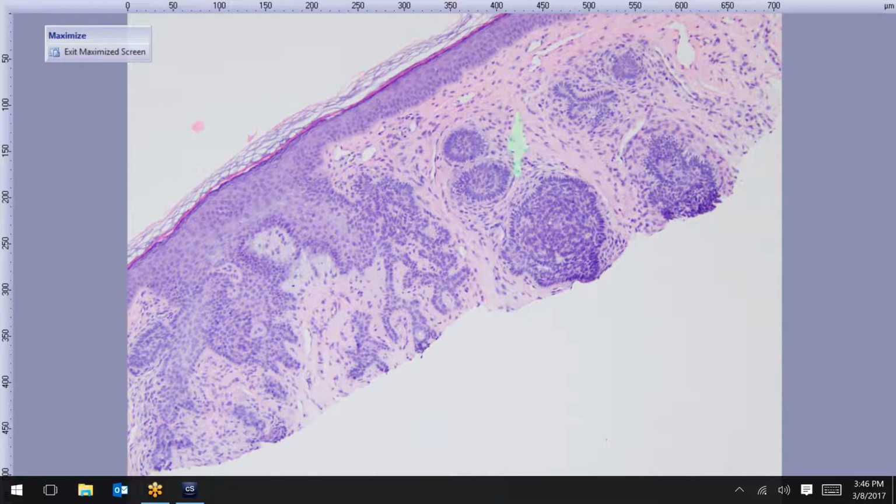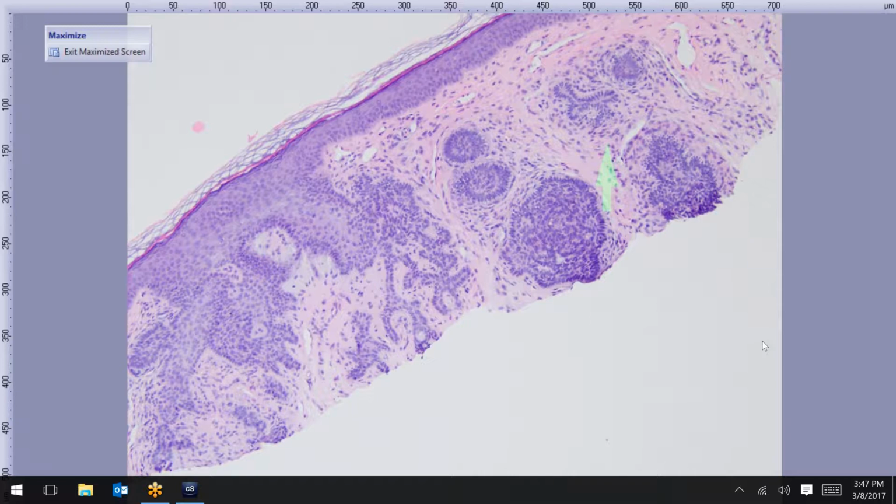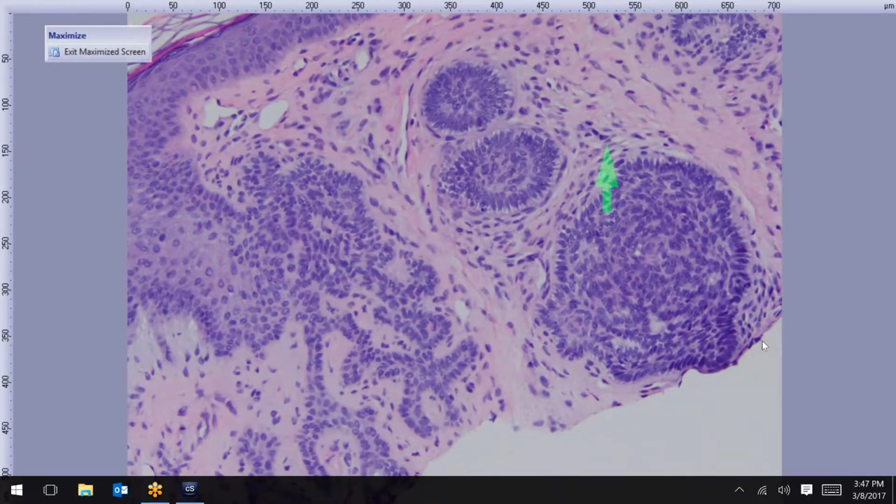And then there's a third thing that just doesn't happen to be present in this case, but typically is, and usually we see horn cysts. So if you have this triad of reticulated basaloid lobules within a fibrotic stroma with horn cysts, it's a trichoepithelioma. So this is a good example, except it just doesn't have our horn cysts for a trichoepithelioma.